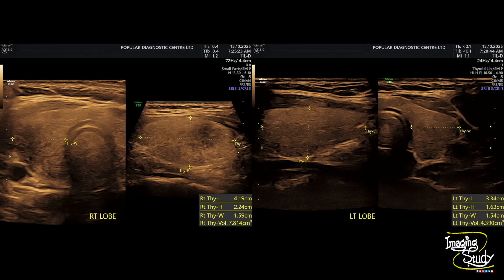Here you can see the ultrasound images of the thyroid lobes. You can see the measurement — the anteroposterior diameter is slightly more than the normal size, so the thyroid gland is thickened or enlarged a little bit.